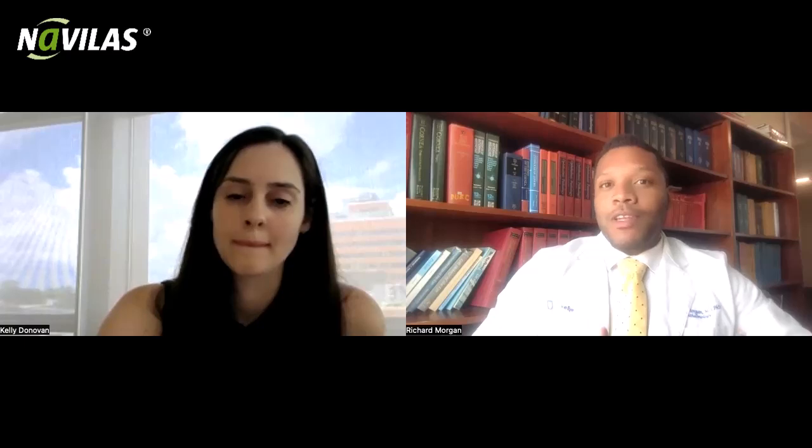So what do you think about the Navilas as an education tool? Yeah. So I think really the obvious advantage of Navilas for trainees is that when we're first starting out, your attending or your fellows looking at the retina describes to you or maybe points to a fundus photo and says, this is where we want to treat. And then you go and look and you're not sure if you found the same spot. I think we've all had that experience where you're like, I'm not quite sure if I need to go a little more temporal, a little more superior.